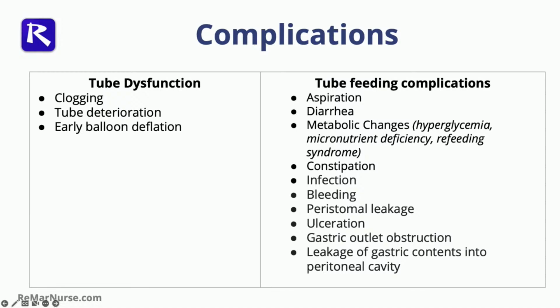No, it could still be in place, ideally, but what we're going to see, not infection. Infection is a different issue. You can have a perfectly fine tube with an infection. So what we're going to see is discoloration. So you can tell by discoloration of that tube.